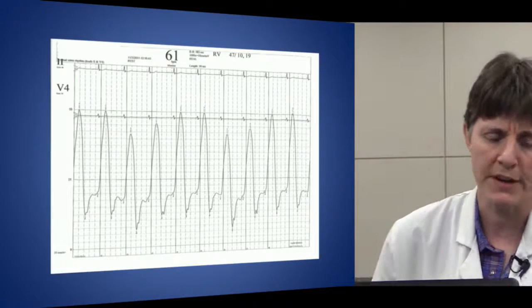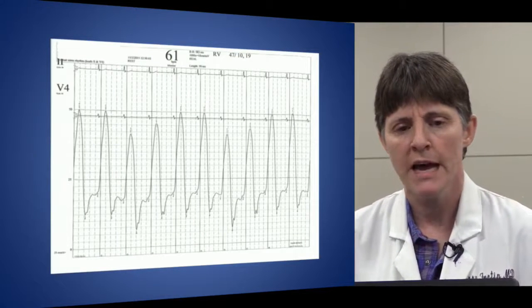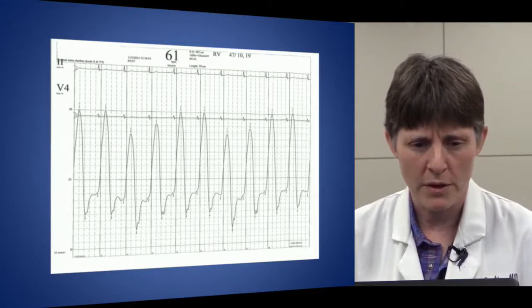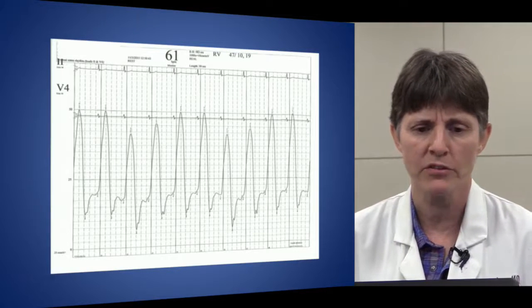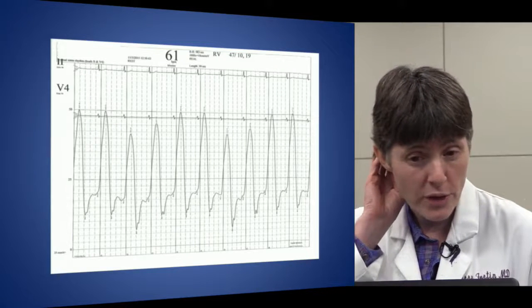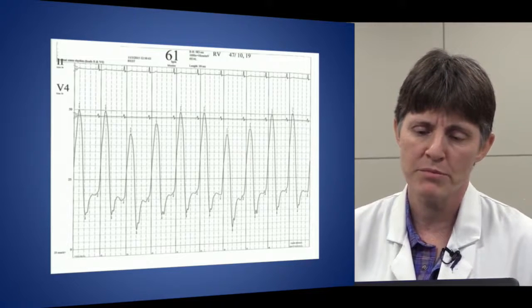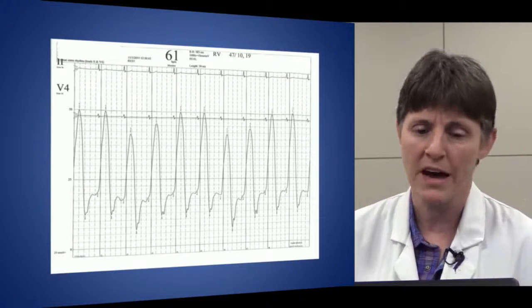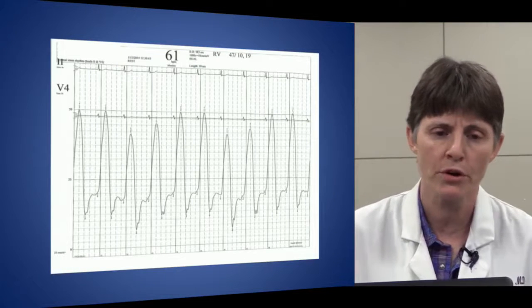This is also a right ventricle tracing. Now again, it's not perfectly round at the bottom like that other one was. And again, even though I know systole is about 50, the bottom diastolic number is going to be in the teens, but end diastole is probably as high as 20, and it's that end diastolic pressure, so that sort of upstroke glitch just before the strong upstroke. And this shape tells us that there's rapid filling with rapid pressure going up, and so it's a non-compliant right ventricle. A left ventricle would look the same if there's some sort of heart failure going on.